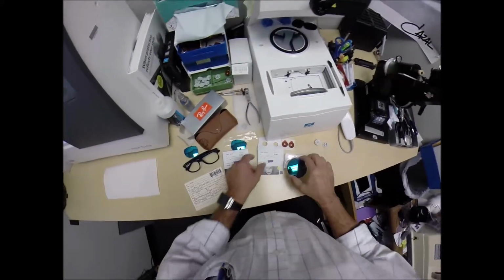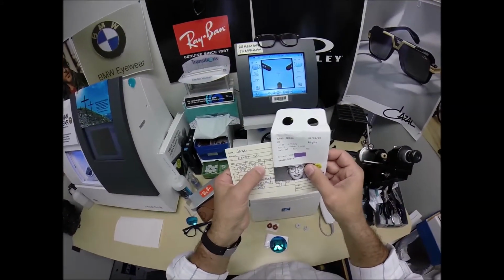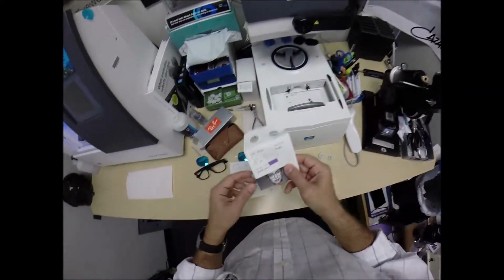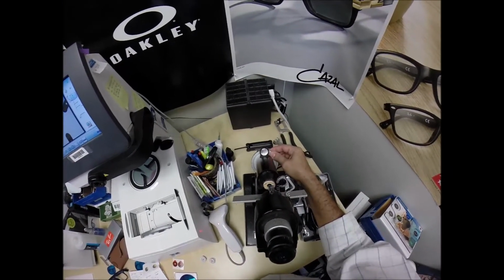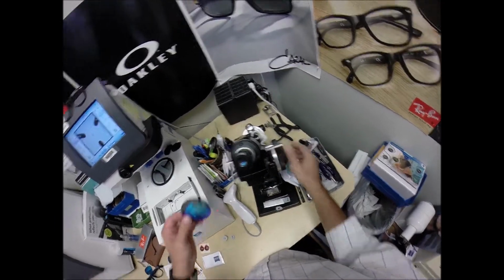I'm going to take your right lens, which the prescription reads minus 2 1/4, minus 1.75 at 176, for the right lens. Put that on 176. I know it's on here somewhere. I shot past. Okay, there we go. I knew we'd come around again on a circle. 176. Put the power drum on minus 2 1/4.